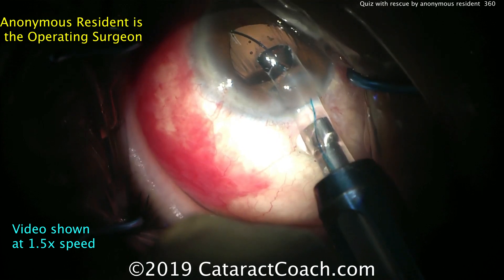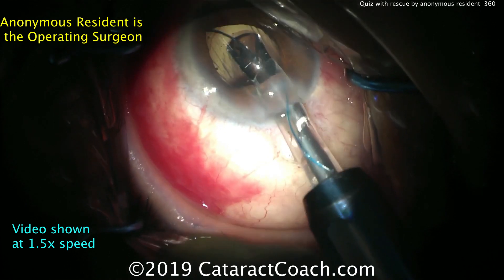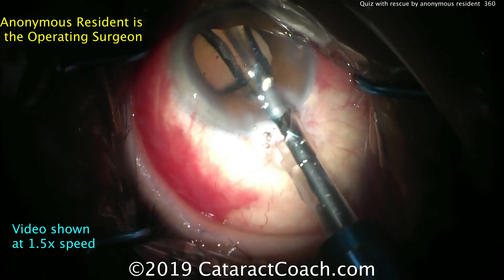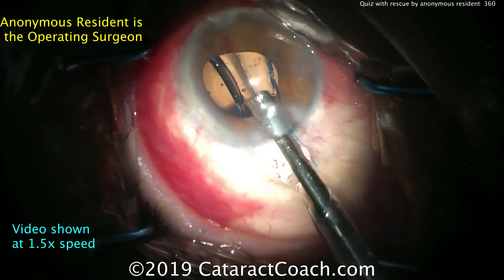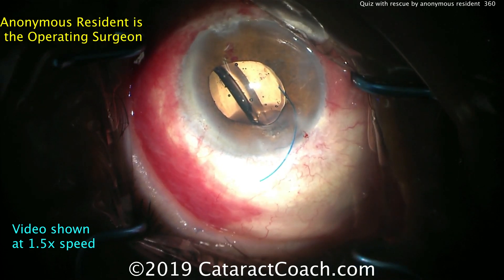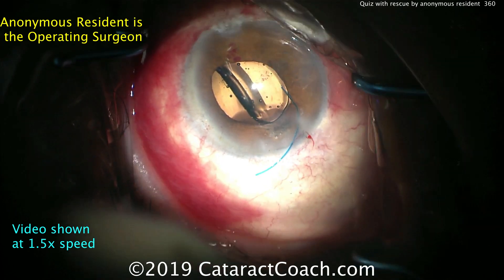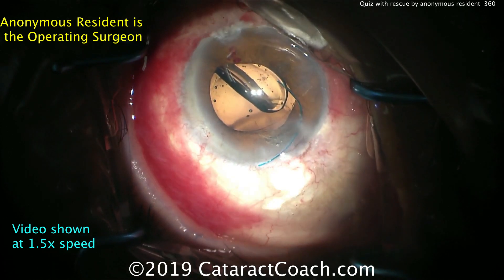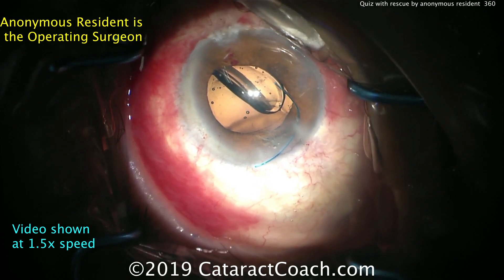Delivering the lens more, and still there's some confusion — what's going on, did it fold the right way? Uh-oh — look where's the trailing haptic? It's not in the correct position. The lens is upside down. That's the problem. So the lens is now going to be flipped.